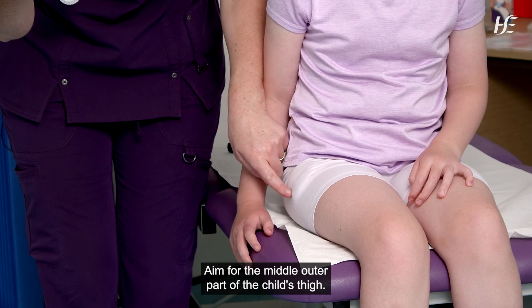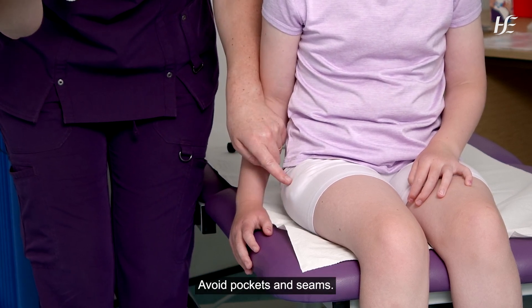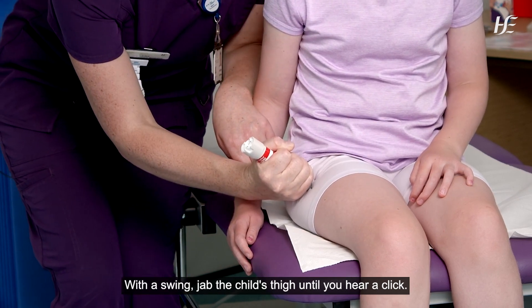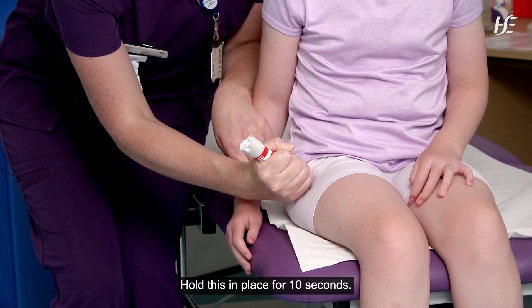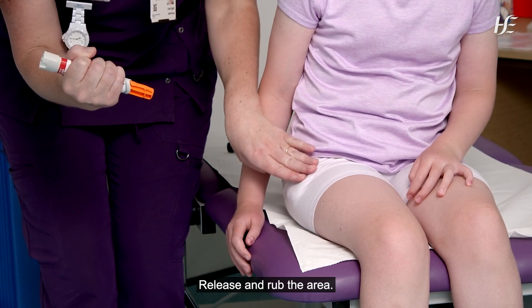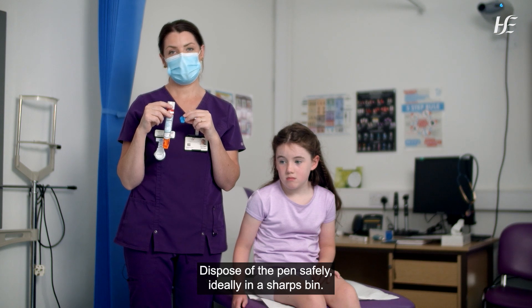Aim for the middle outer part of the child's thigh. Avoid pockets and seams. With a swing, jab the child's thigh until you hear a click. Hold this in place for 10 seconds. Release and rub the area. Dispose of the pen safely, ideally in a sharps bin.